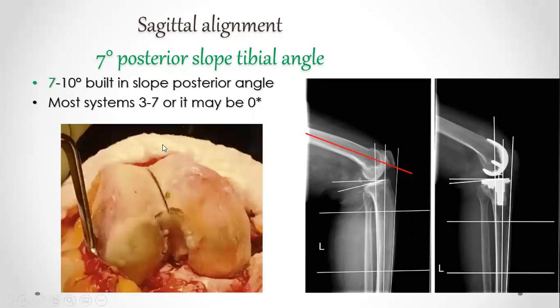So regarding the femur in the sagittal plane, it is the same story we did in the coronal. You can see the sagittal plane anatomic line, 2 points here, 2 points here, and then you can add this line which is the center of the medullary canal. From the Blumensaat line, it is a few millimeters away, and this point on the AP and lateral represents the entry point of the intramedullary guide that we talked about, which was 6 degrees valgus.